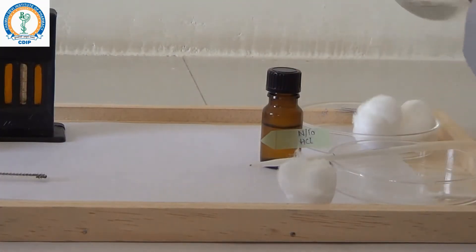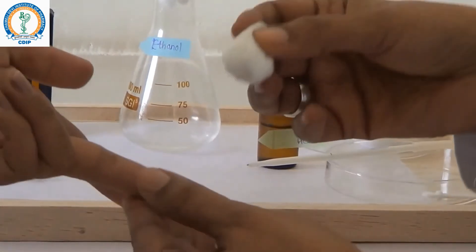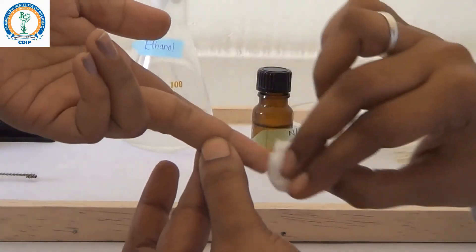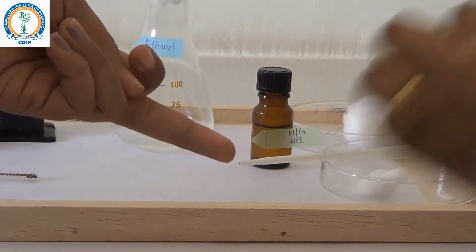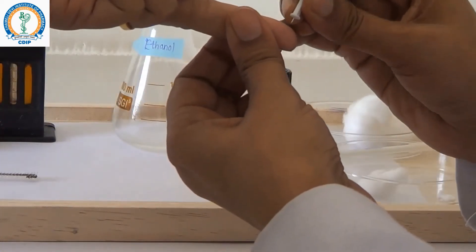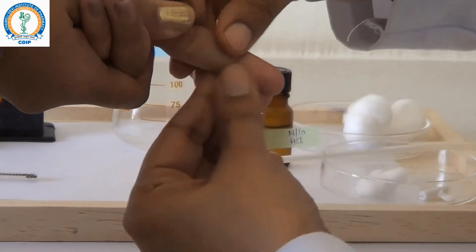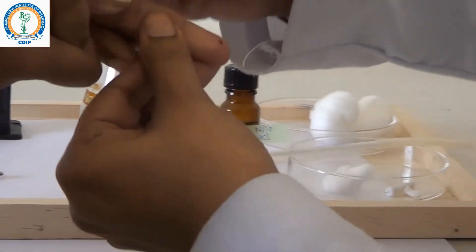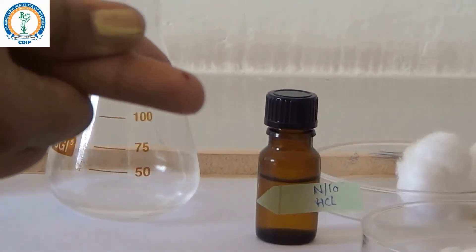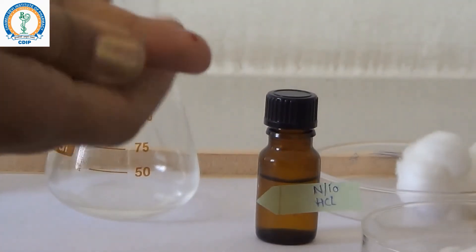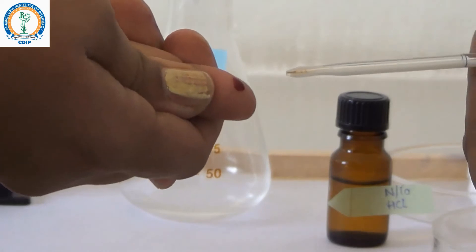Now, sterilize the finger with ethanol and prick the fingertip with lancet. Let the blood ooze out from the fingertip and make a huge drop of blood so that it gets easily filled up in the micropipette of 20 microlitres capacity.